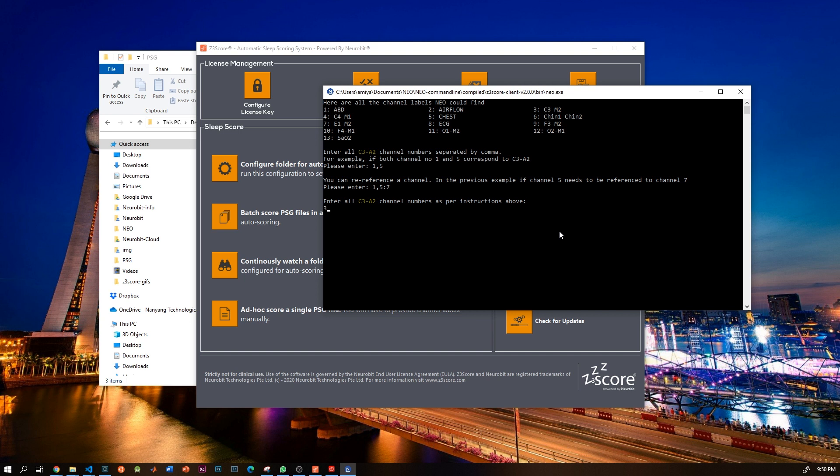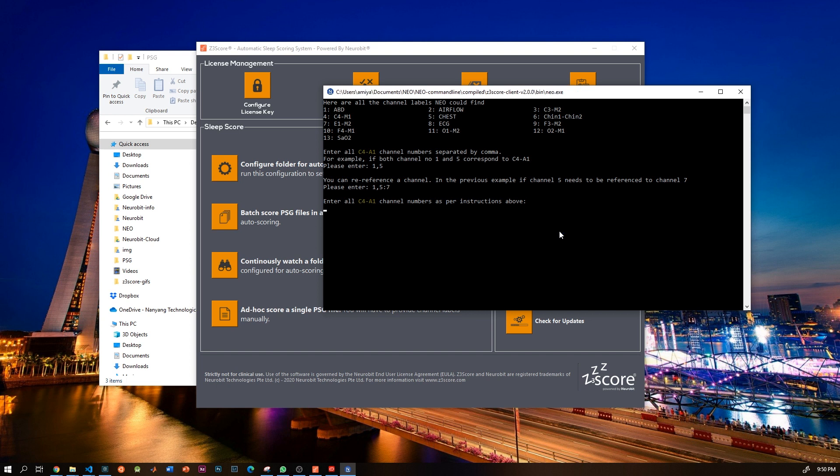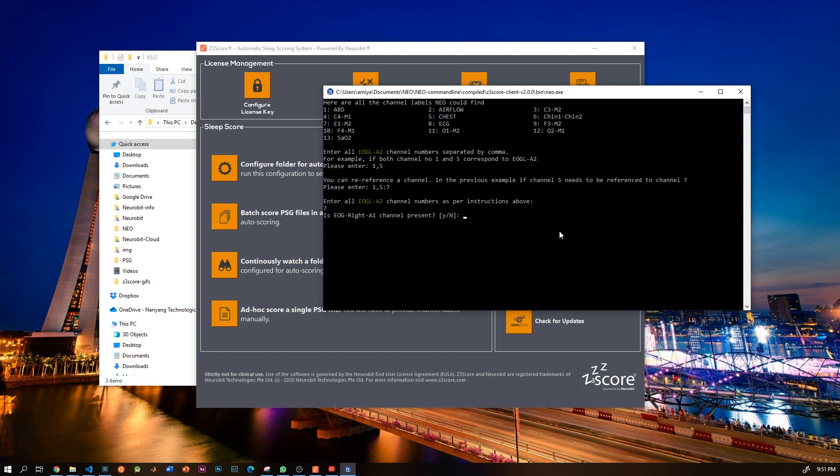Next question is: is C4-A1 present? And the answer is yes, and the channel number is 4. Is EOG left A2 present? And again the answer is yes, and is channel number seven. Is EOG right A1 present? Well in this case it's missing, so I will say no.